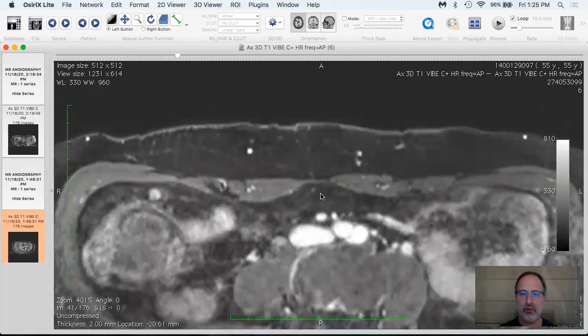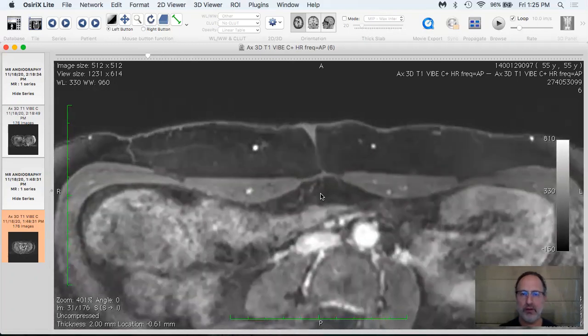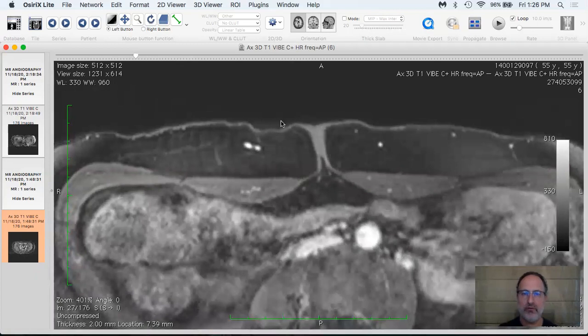And just to give you some orientation on this belly button image, the most superficial, or the uppermost part of the anatomy that you see here is the patient's skin. Right below that, you see fat. Okay, and then right below that, you see the rectus abdominis muscles. And right below that, you see the intra-abdominal contents, this being the bowels and this being the aorta here.